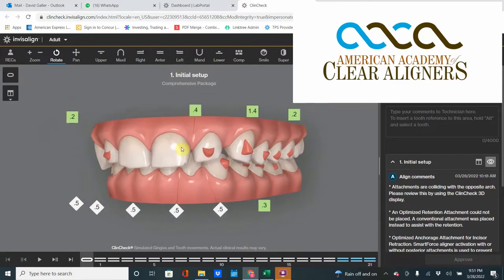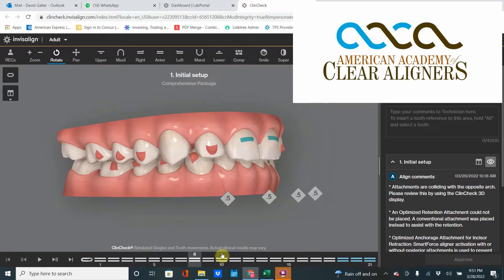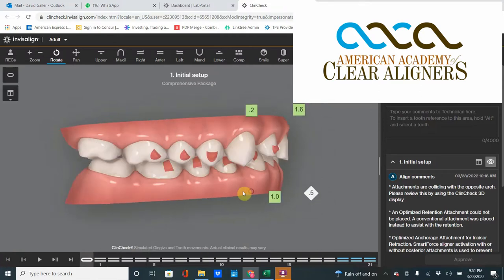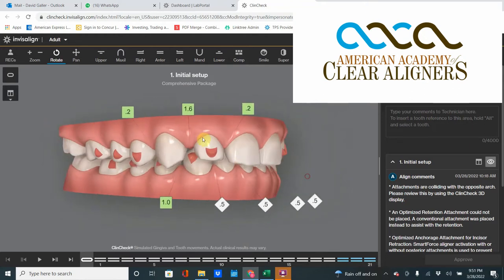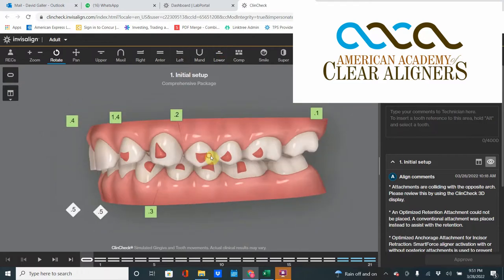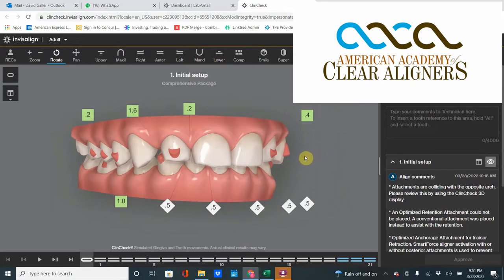Sometimes looks can be deceiving. What seems on paper like an anterior spacing case with some lower IPR to close it all in — a textbook Invisalign case — is not. This is a no-treat as is. This is a posterior bite collapse, and I don't know how to teach it other than to just eyeball it: when things look collapsed and you can tell it's a very heavy grinder with significant wear, this is a combination prosthodontic and Invisalign case — it's not an Invisalign treat on its own. This has been ClinCheck Theater Thursday and I am your host, Dr. David Geller.